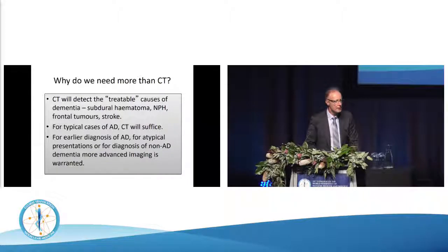All the talk about amyloid PET certainly has stimulated interest in molecular imaging amongst memory disorders specialists once again. The automated quantitative programs now give more reliable assessment, as I'll show you, and even the referring doctors, if you send them pictures of the automated quantitation surface rendered maps, can see what's going on and can read them themselves, which is very good for referring doctors.